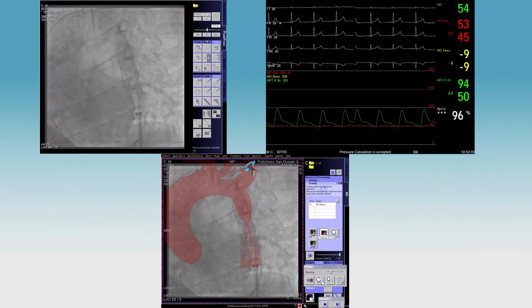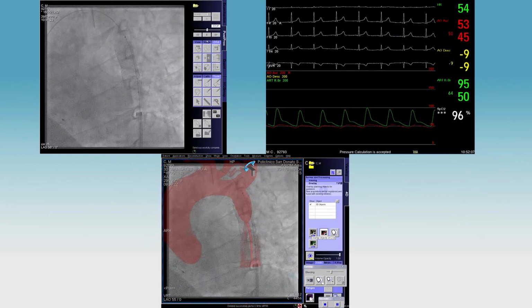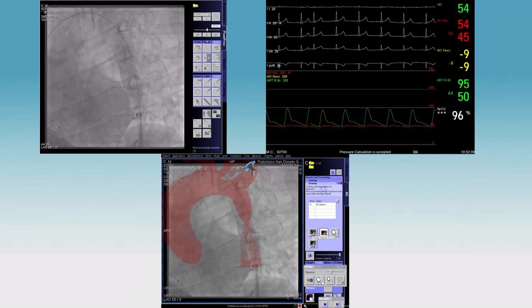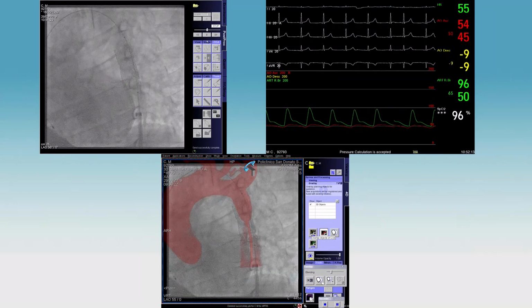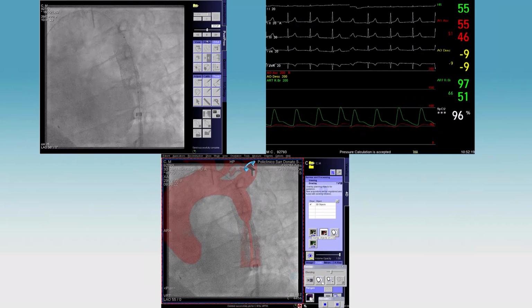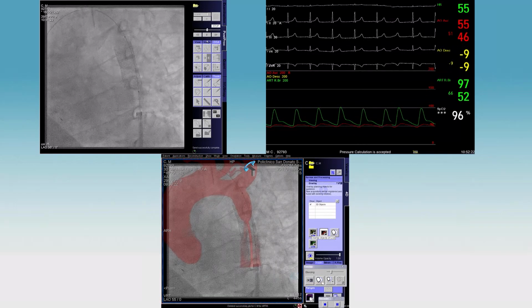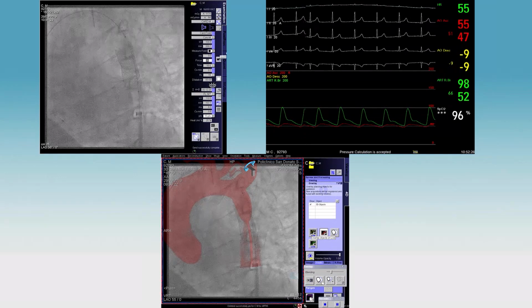How much pressure does this balloon take? Well, it can go up to 6, but I'm now at 2, and it looks as if the lesion's given, hasn't it? So I'm going to just maintain it at... Compliant lesion then. Yeah. So I'll just go up to 4, just to make sure we're about there. Okay, so deflate.